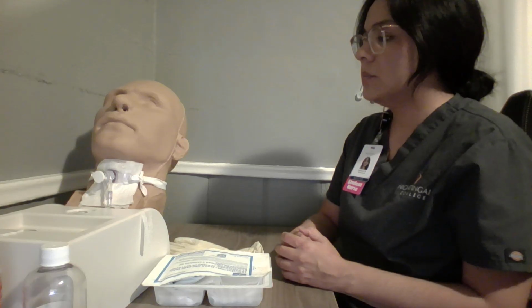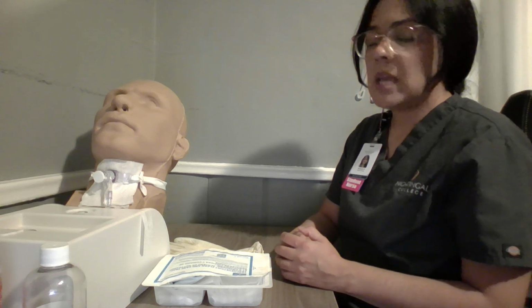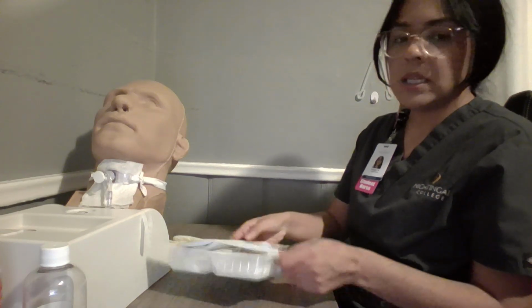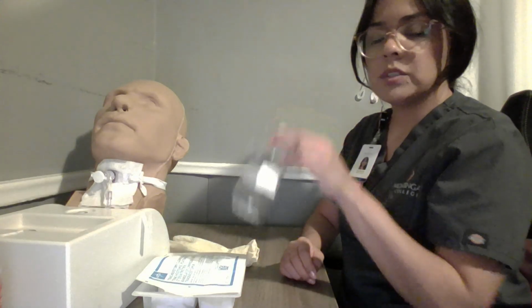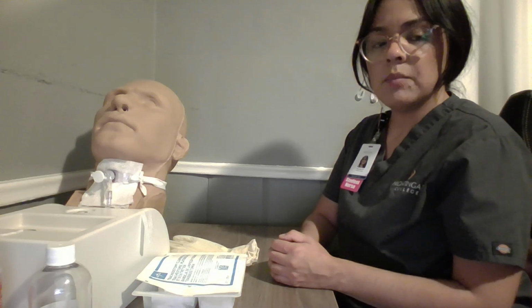Is that okay? All right, so I will explain the procedure with duration, and I will ask if my patient has any questions. I will collect my supplies. They include a clean pair of gloves, a tracheostomy kit, a container for our normal saline, and I also have hand sanitizer. I will start off by checking the provider's orders in the EMR.